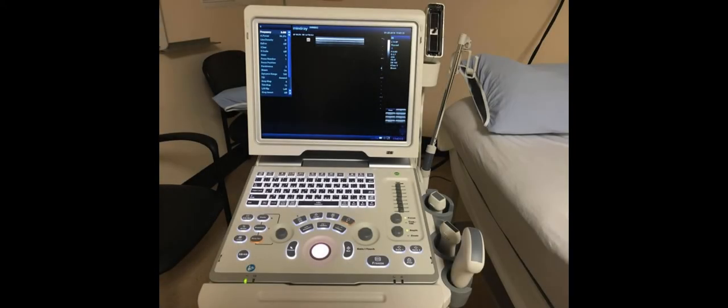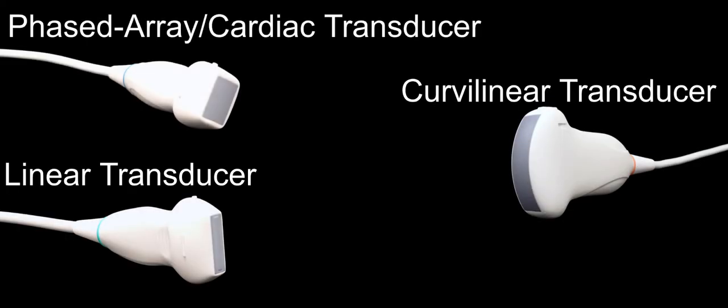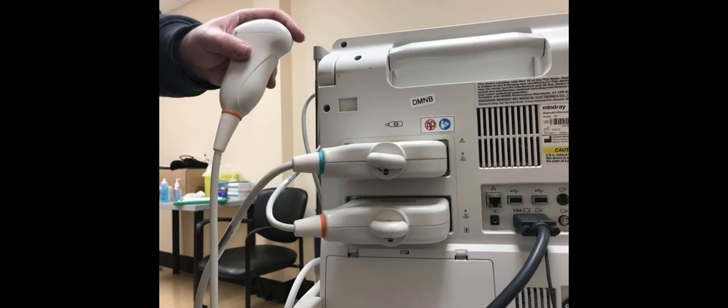This machine has three transducers: the curvilinear transducer, the linear array, and the phased array transducer. To start the scan, we need to turn the machine on. Next, we have to ensure that the transducer that we want to use is connected to the machine. With this machine, note the helpful color coding corresponding to both the transducer and its connector.